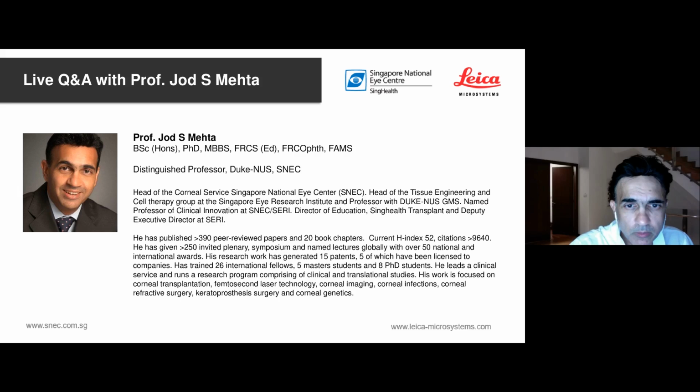That's a good question. I think the answer is yes, because you can learn some of the things that I showed you, and that will build up over time, and you'll get an idea of how the grafts will behave inside the eye. But one of the issues is that it may take quite a number of cases before you get a handle on being able to do the surgery itself.